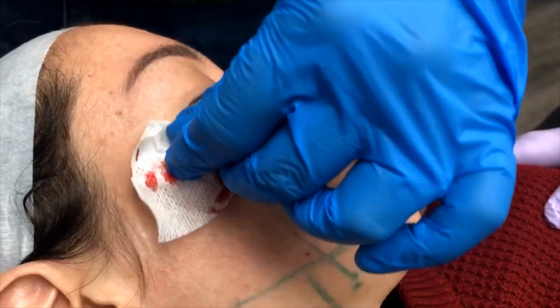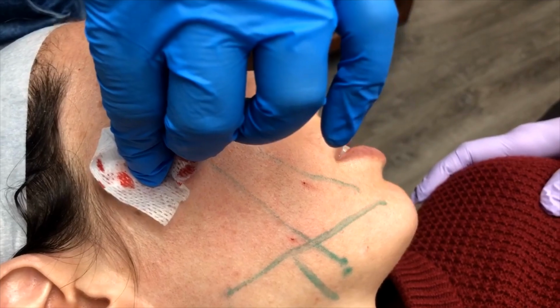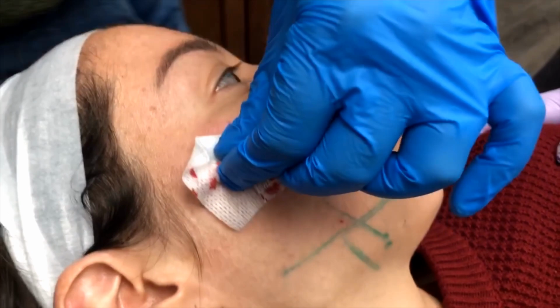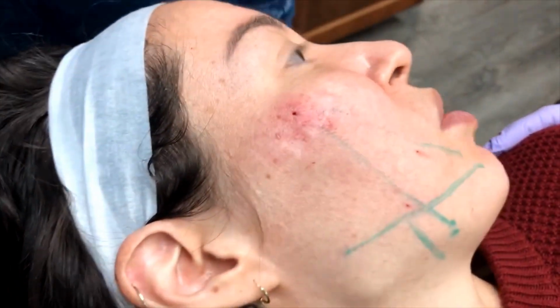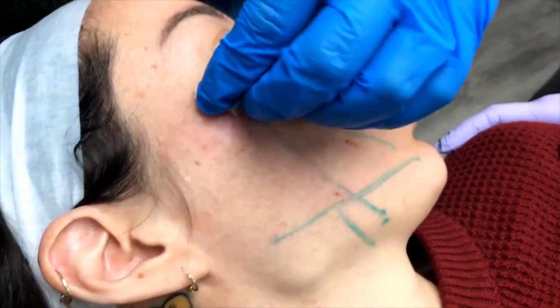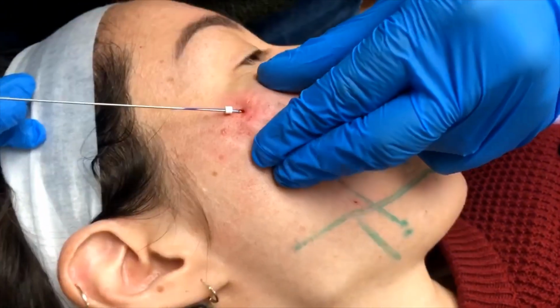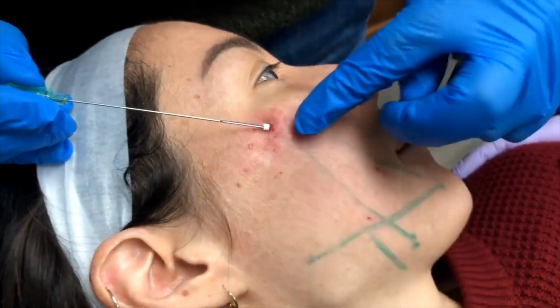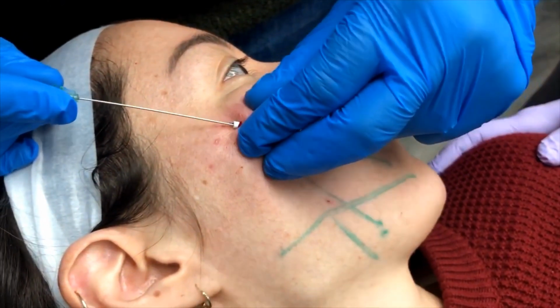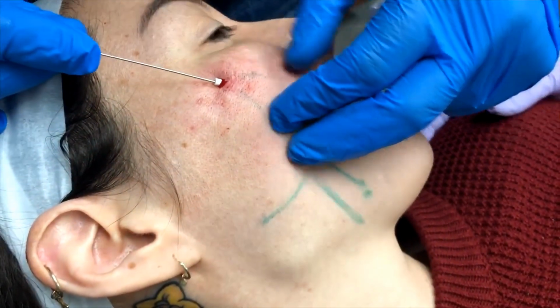So now we've pre-tunneled, we've delivered lidocaine 2%, not much. We don't want too much liquid in there because we want our PDO lifting thread to be able to really engage here. Now let's take a look. She's now ready for the lifting, the PDO lifting thread. So we are going to place this. We're only using 2 threads. Why is that? So many other companies will use 4 to 6 to 8 to 10 threads for the same case, because we are using V-Soft Lift. These are the best lifting PDO threads on the market here, and the strongest by far, and produce the most collagen.